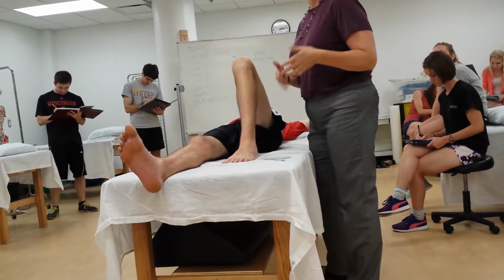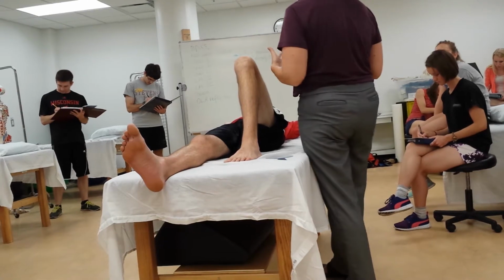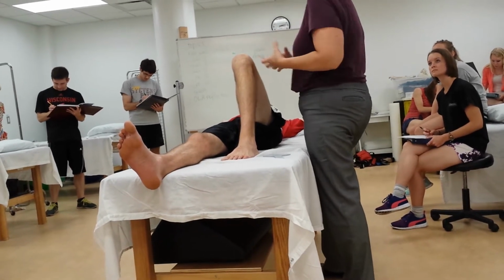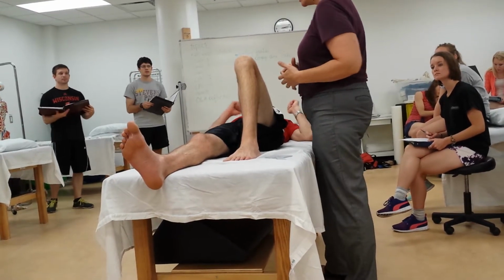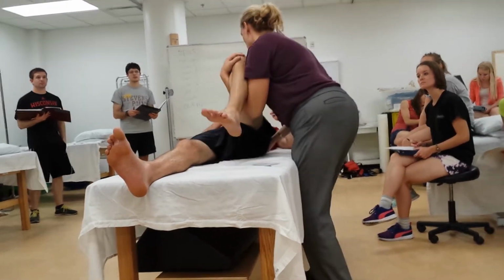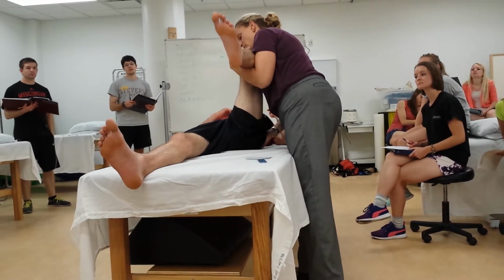Now, because legs tend to be heavy and big, I don't have a problem with asking the patient to physically hold it with their hands once I get them in the position I want. Okay? So, come back up again. I know actually like for me.